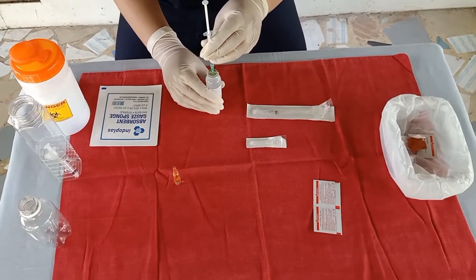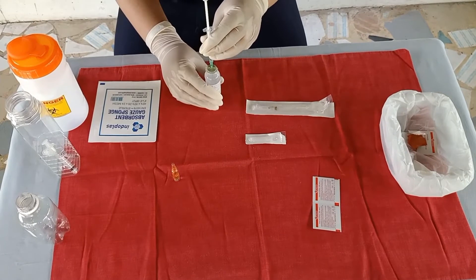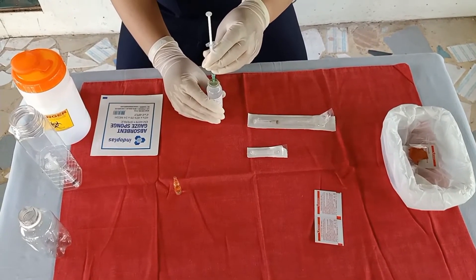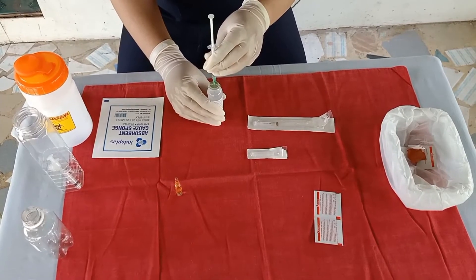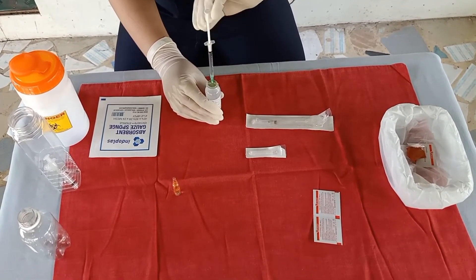When the correct volume of medication is obtained, withdraw the needle from the NSS vial and replace the cap over the needle using the scoop method, thus maintaining the sterility.